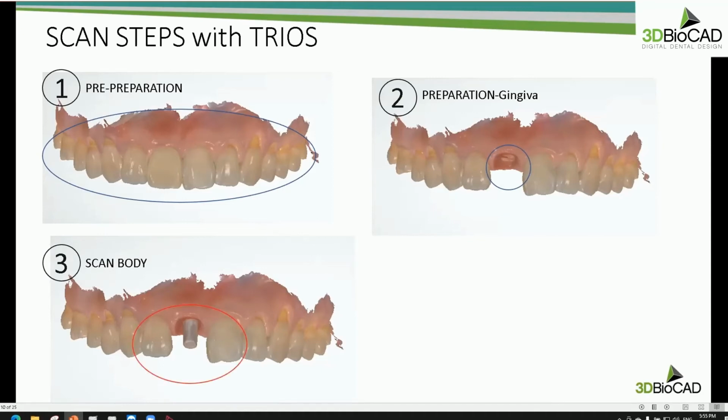The reason why I pointed out a little wider range than the gingiva is this: as we know, all the intraoral scan workflows or technologies capture the images and then render and stitch them to each other, right? So whenever you have the scan body scan, if you focus on only the scan body, that means there's no right position information for the scan body with our gingiva scan.